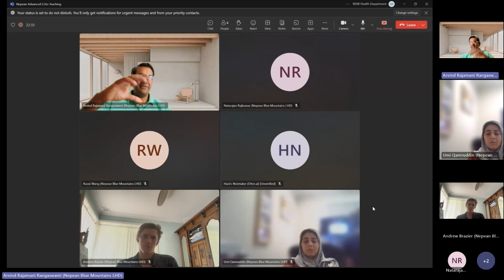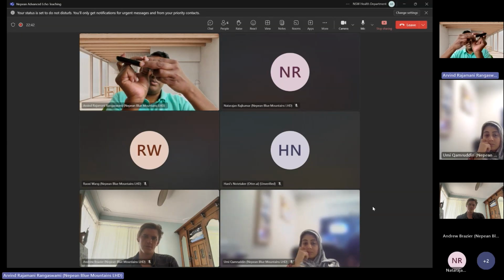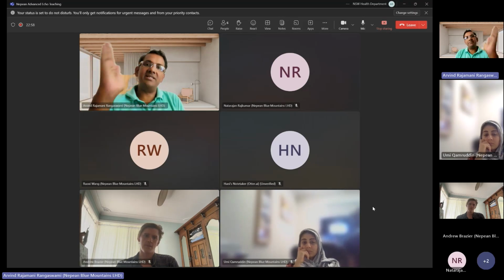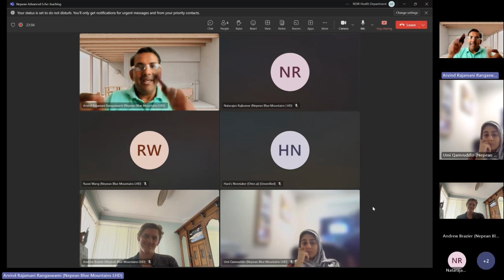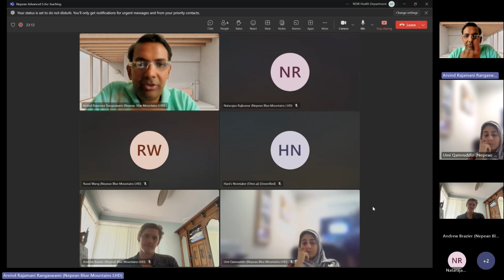When you're transverse, if this is the vein, then the entire vein is going to be under the probe, and therefore the pressure is going to be applied all across the vein. On the other hand, if you're longitudinal, then you might slip off on one side or the other. It is not uncommon, and remember that the thigh is a slippery slope, and you have gel on it. If you're applying pressure, it's going to slide down. It's very common for it to slide down laterally, even by a centimeter, and you will lose the plane of the vein completely.